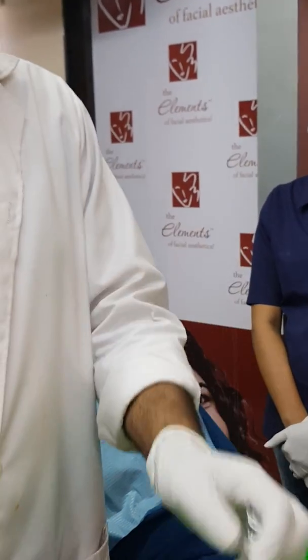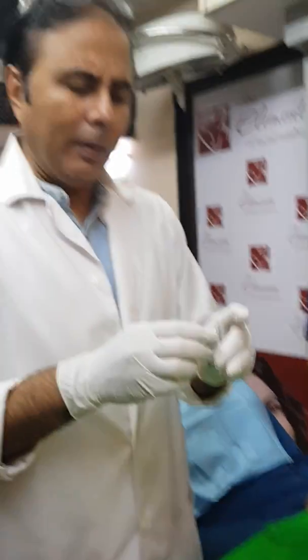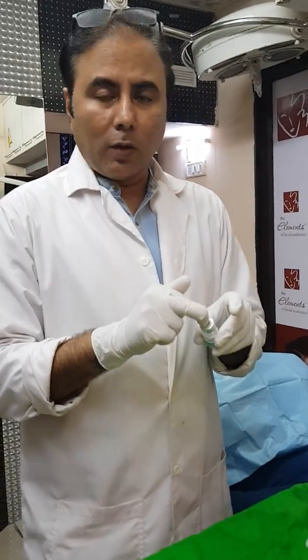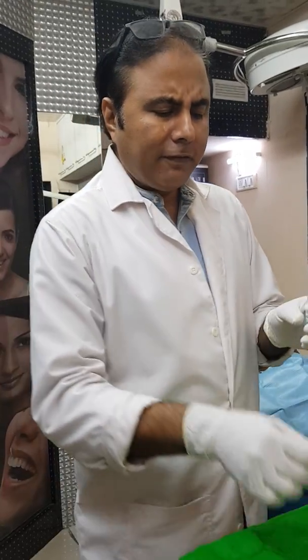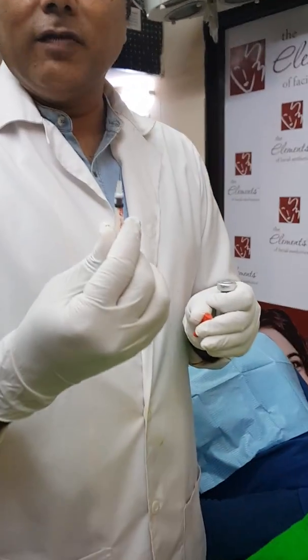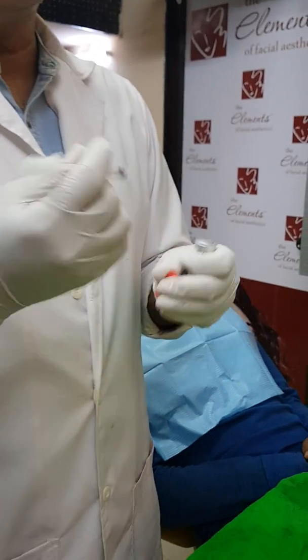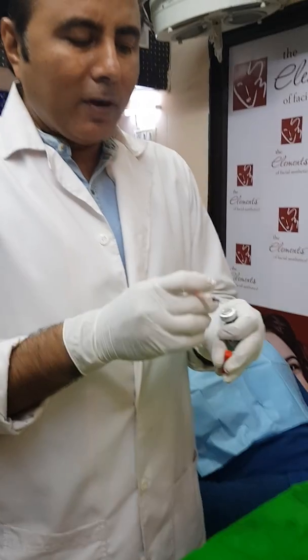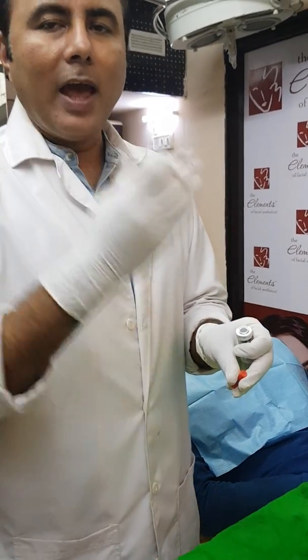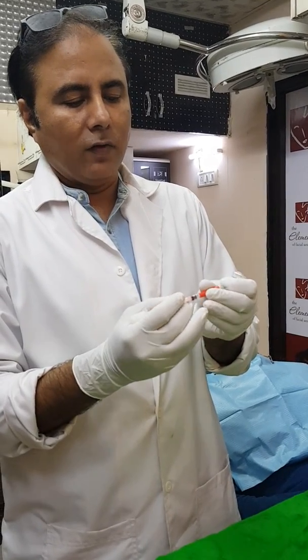Some people inject directly through the rubber stopper, but I personally feel that since this is a 31-gauge needle, going through the rubber stopper makes it pretty blunt. I would prefer to open the vial and withdraw the required amount, then inject wherever needed.